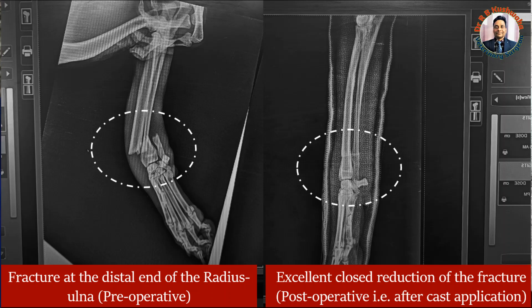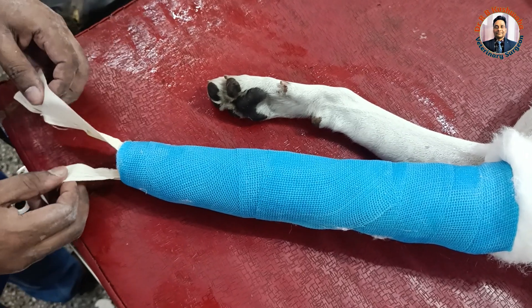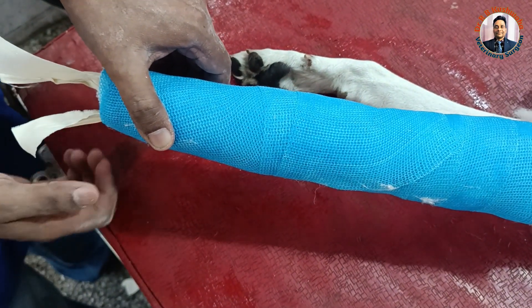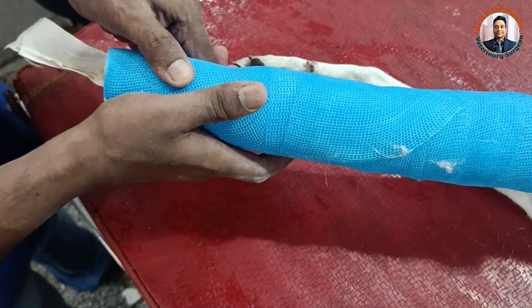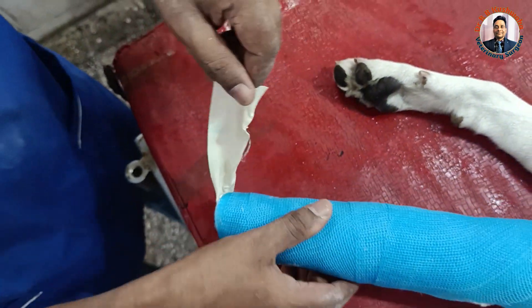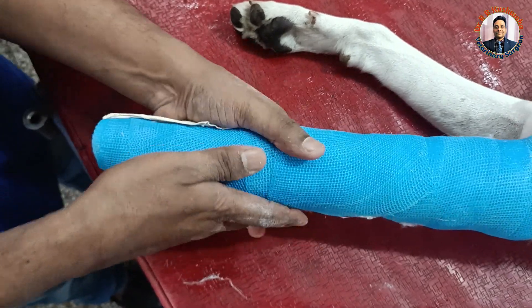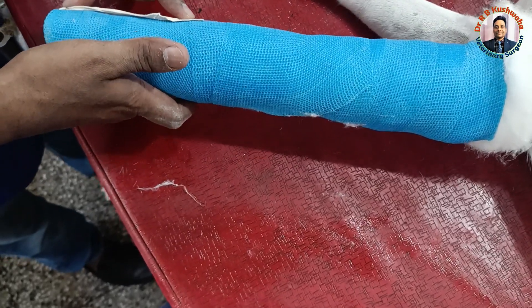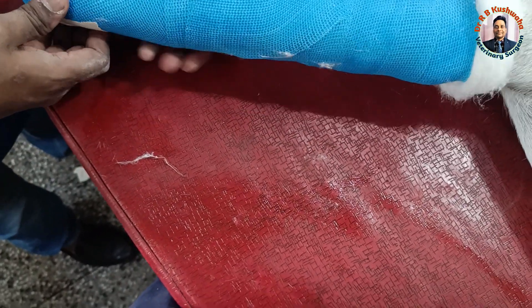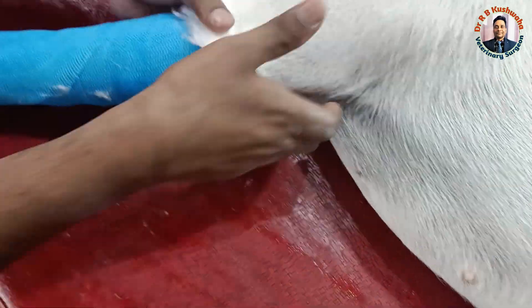I have already told you that reduction of the distal end radius-ulna fracture is difficult. The adhesive tape we applied at the distal end for traction — now we separate it, twist like this, and paste over the caudal surface. This one is the cranial surface, over the anterior or dorsal surface. In the forelimb just below the carpal joint, this is called the dorsal surface. We remove the extra cotton and put it like this.